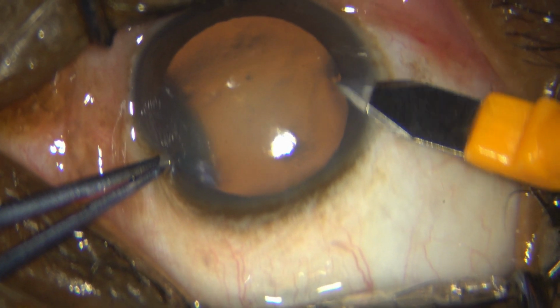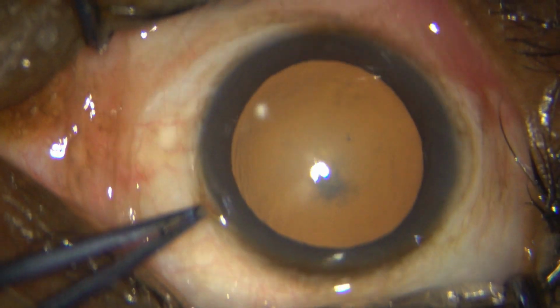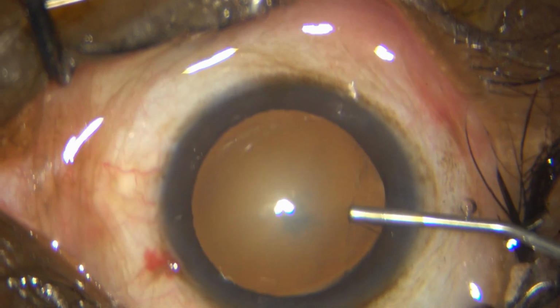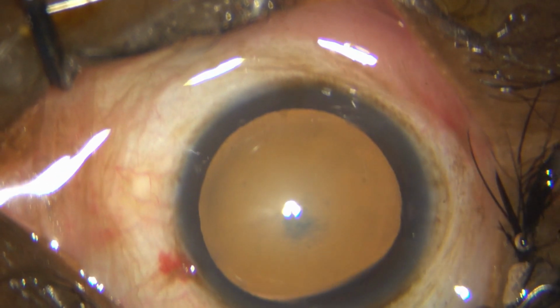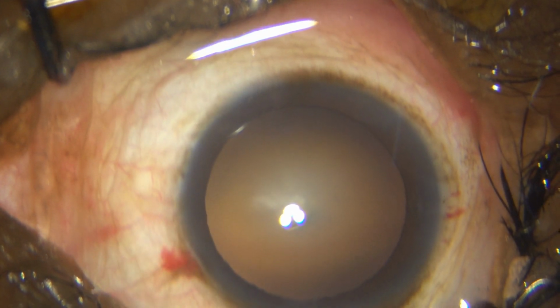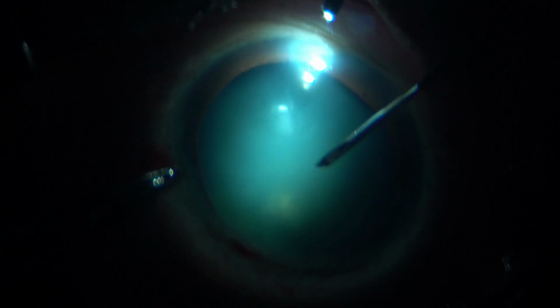So initially, I of course start off with my incisions, and here was the first mistake, I suppose. I made a regular side port incision. I should have made a much smaller incision because I'm going to use that for the endo illuminator. Initially, I asked my assistant to hold the endo illuminator at the limbus for me to attempt my rexis, as I was using both my hands. And this is not such a great idea. I was hardly able to see.